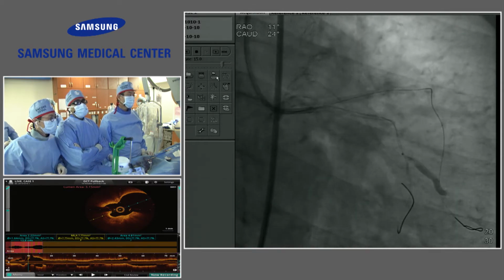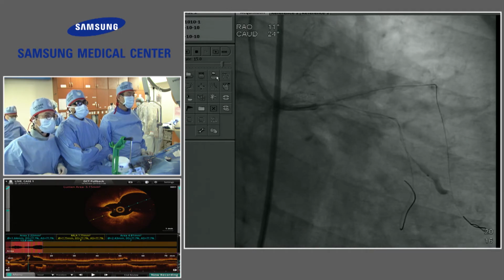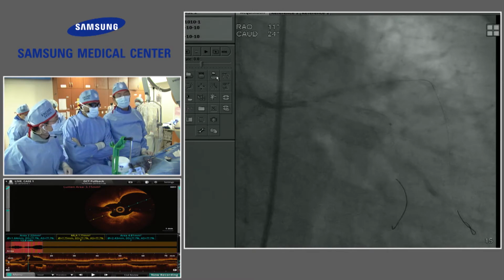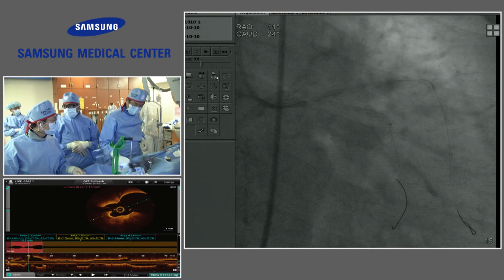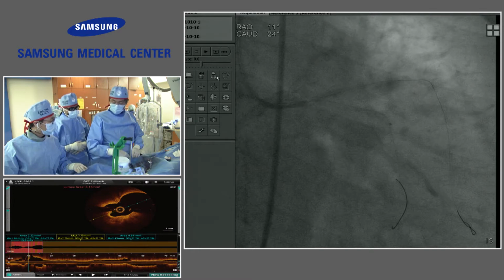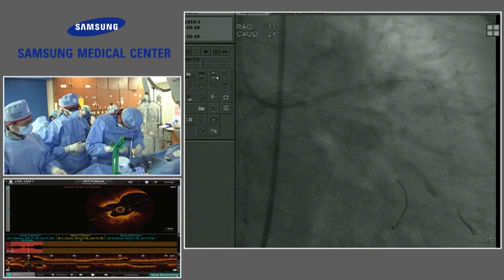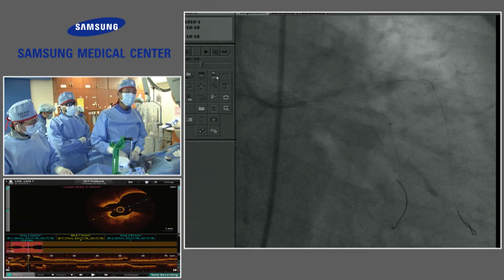The patient is stable hemodynamically. Heart rate is 52. Blood pressure is 118/63. And we may have to allow these dissections to heal. So maybe we'll do an IVUS now. IVUS, please. Run through wire. So this is a classic example of the perils of severe calcification.